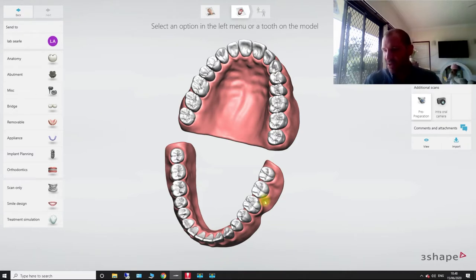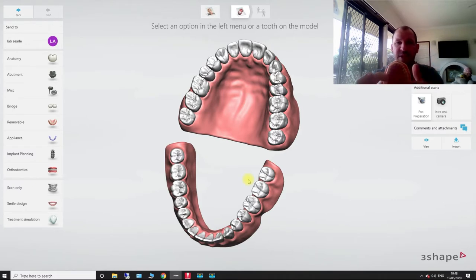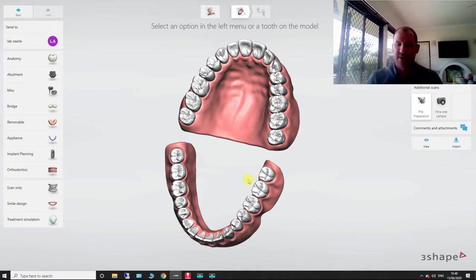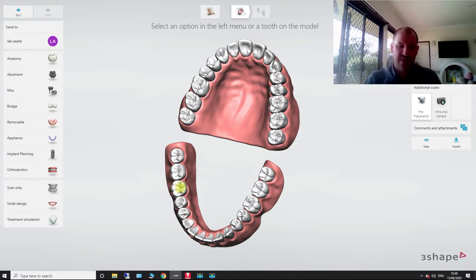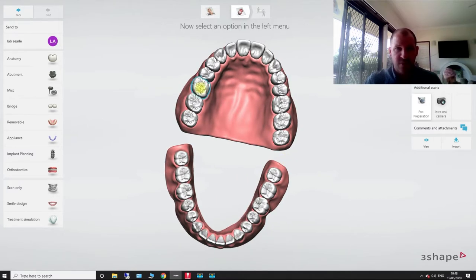And then once we go into here, I've got my model here, which this is my implant over here. So that is our 1-6. So basically we're going to click on 1-6.